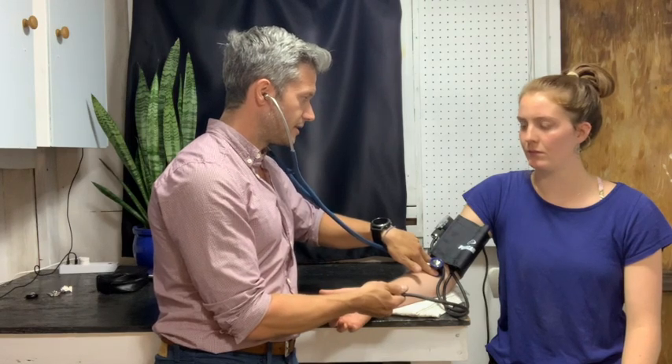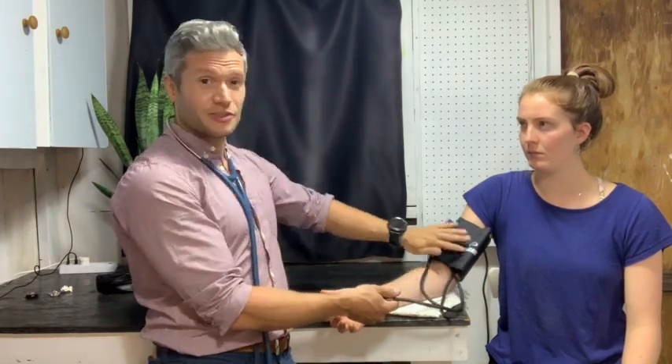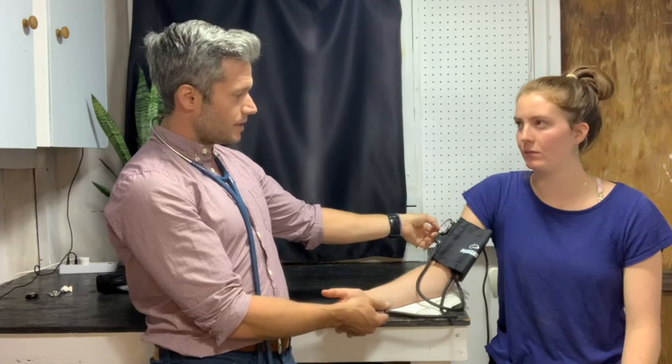Still hearing beats — starting to get a little softer. And now it's gone. I noted just when that last beat was. I'm immediately going to let all the air out of the blood pressure cuff to ensure that circulation is getting back to Tully's hand and forearm. I'm going to look back and think: I heard the last beat between the hash marks 70 and 60 — it was just one below 70, so I'm going to say 68. That was the last time I heard any beats coming through — the Korotkoff sounds. So I can go and quickly make a little note: 120 over 68.